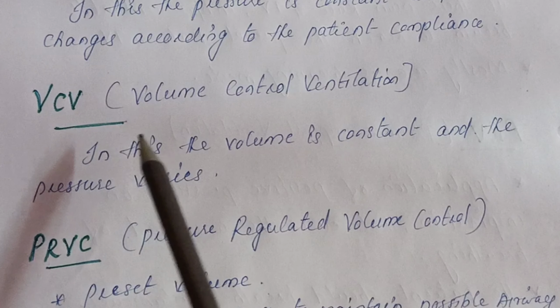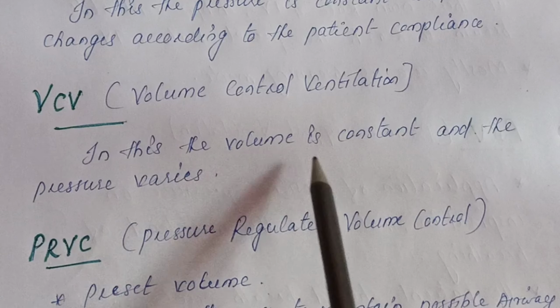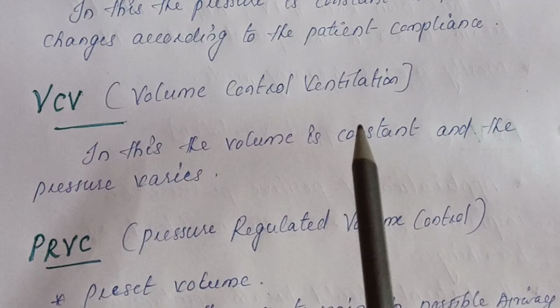Next one is volume control ventilation. In this, the volume is constant. So in the ventilator, we can set the volume and the pressure varies according to the lung compliance of the patient.